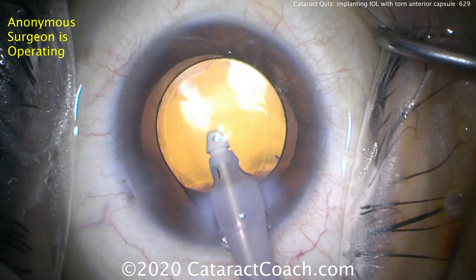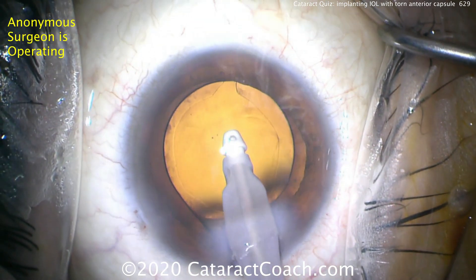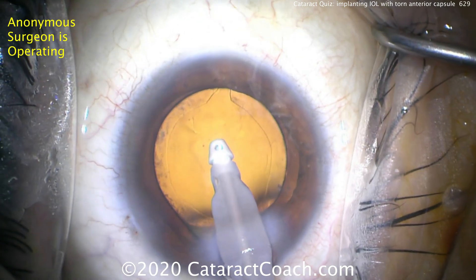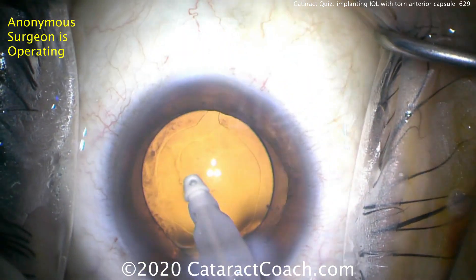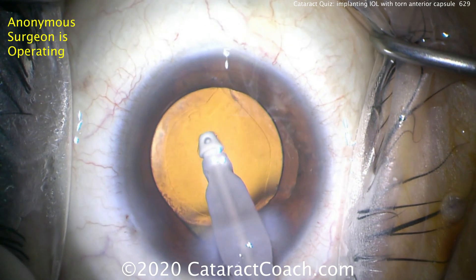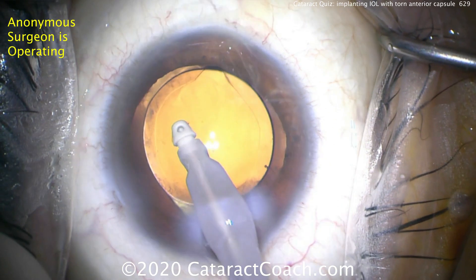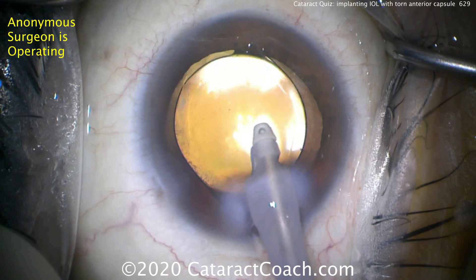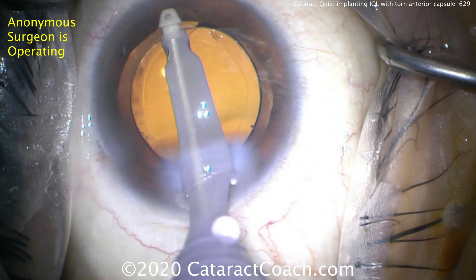Here we can see the lens in good position. Removing viscoelastic — with a single piece acrylic lens you can have the haptics in any orientation you want. My advice: the less intraocular manipulation, the better. Leave things be. This patient will have a beautiful visual outcome with no untoward effects from this anterior capsular tear. But if you allow that tear to go to the equator and then to the posterior capsule, we're going to be in a host of trouble — so we want to avoid that.